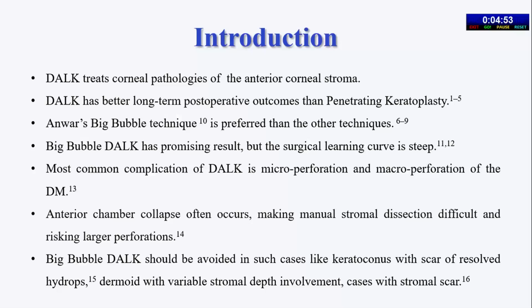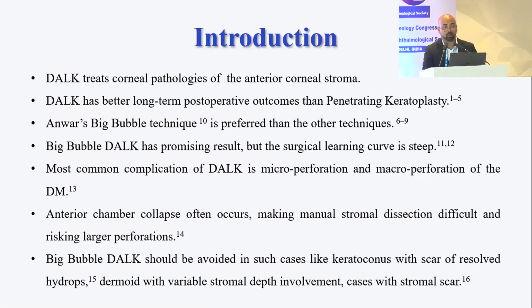Generally, we use DALK to treat anterior corneal stromal pathologies. The Anwar big bubble technique is the most common technique we use, but there are complications like macroperforation or microperforations. We don't try to use this technique in cases like keratoconus with hydrops or dermoid with variable stromal depth. To combat this situation, we tried to develop a modified technique of DALK using a diamond ophthalmic bar.